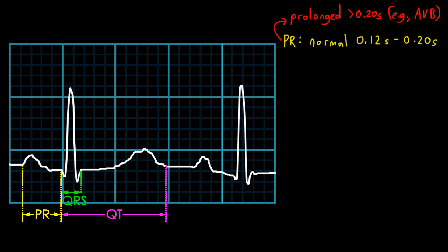When the PR interval is short, it indicates that for whatever reason it takes less time for the impulse to make it from the atria to the ventricles. Most commonly you can see this in patients who have an accessory pathway, such as what is seen in the Wolff-Parkinson-White syndrome.